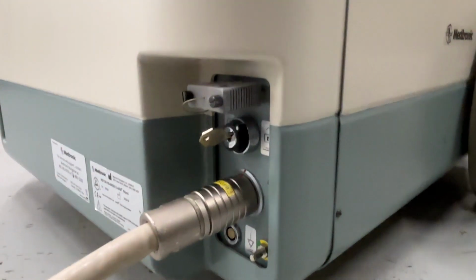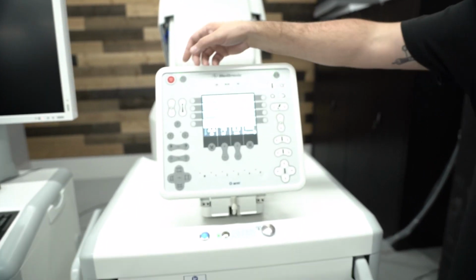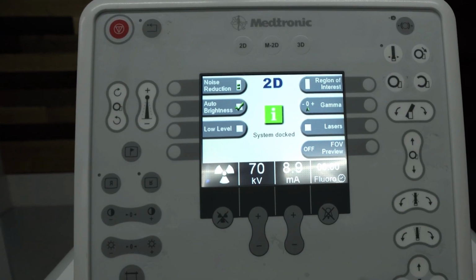On an O-arm, you'll go to the base of the unit to find this. Back up here, we should now be able to reset the E-stop and carry on.